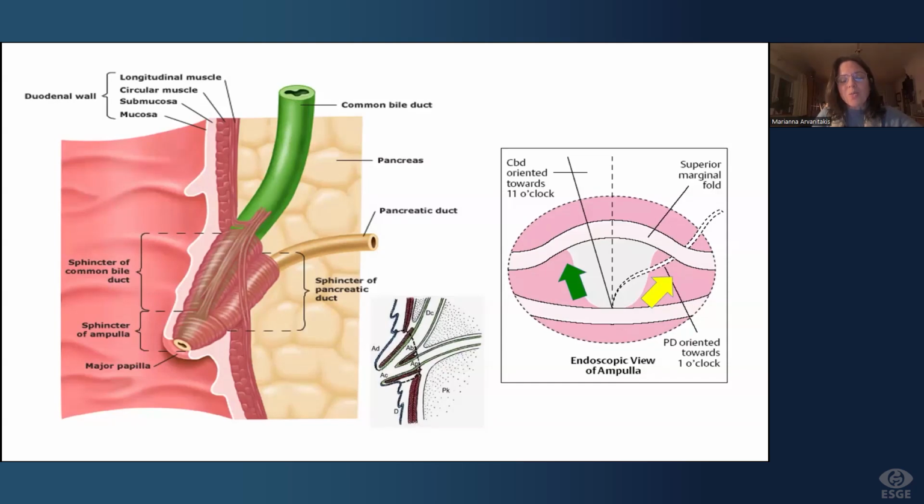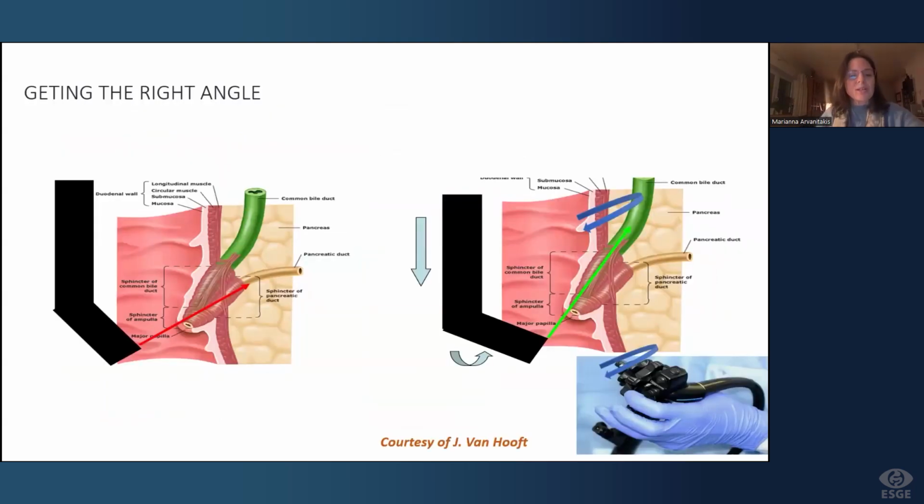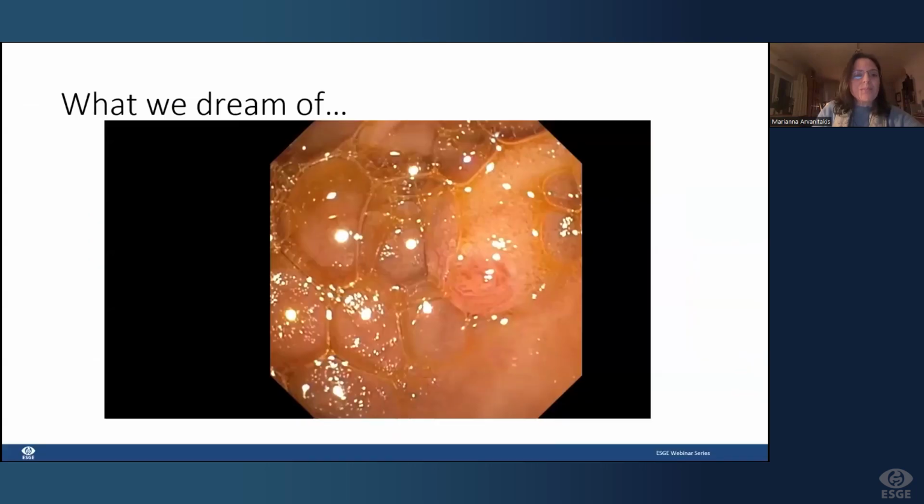And this is where we get sometimes involuntarily in the pancreatic duct when we want to go into the biliary duct. And as we talked about these directions, we see that when you're down with the duodenoscope, you can use your duodenoscope to get the good direction by pushing a bit further down, by turning your little wheel to the right, and to have already a good direction where your papillary orifice is a bit in the middle, but a bit above in the screen. So when you're going to use your device, you'll be coming from below the papilla.